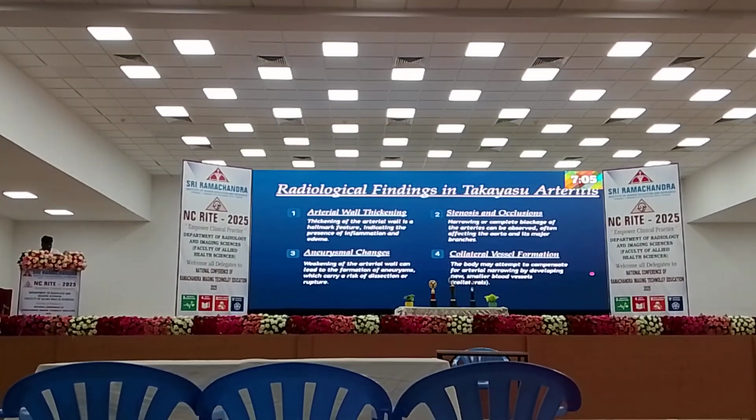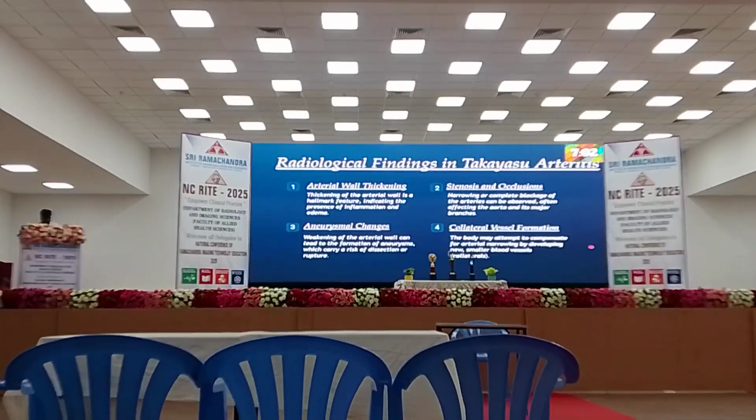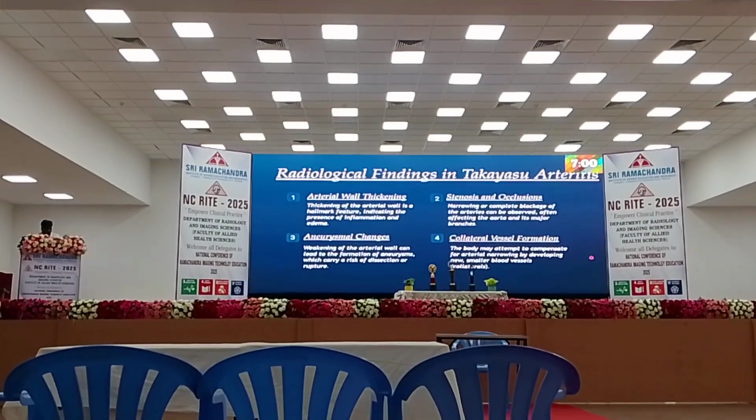Radiological findings in Takayasu Arteritis. First one, arterial wall thickening. Thickening of the arterial wall is the hallmark feature, indicating the presence of inflammation and edema.